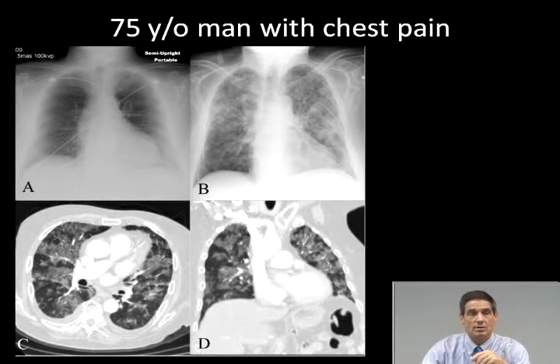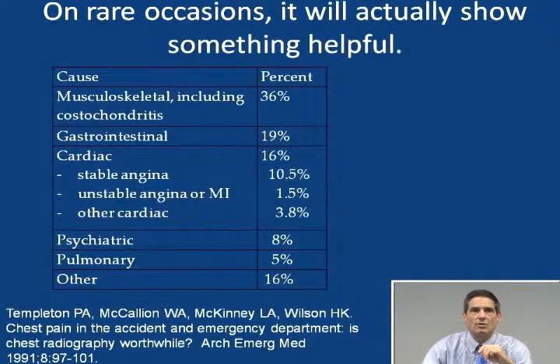Again, this is a very unusual cause of chest pain. So again, this is the table showing you why most of the time you're not going to see a lot of stuff going on with a chest X-ray in patients that come in with chest pain. Okay, so that brings us to the next topic.